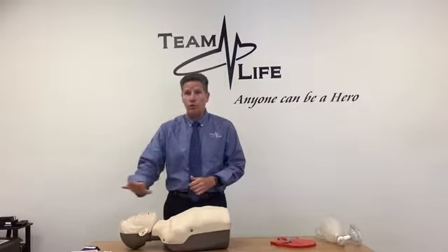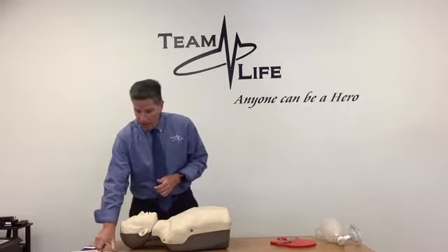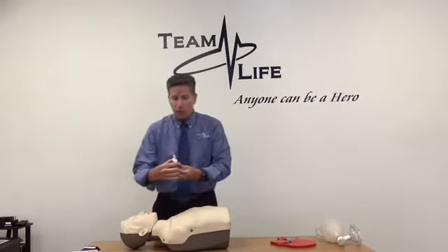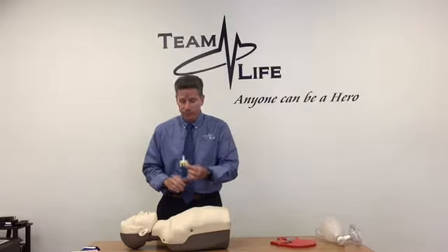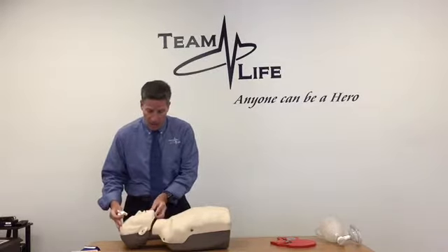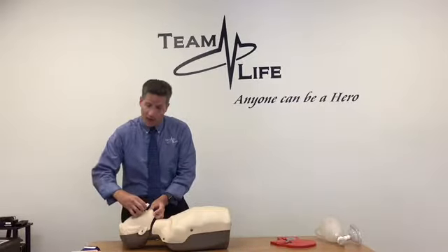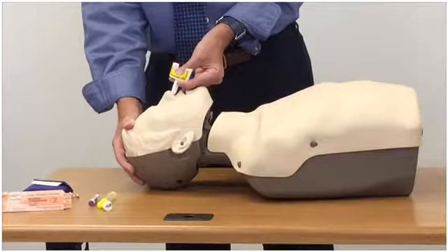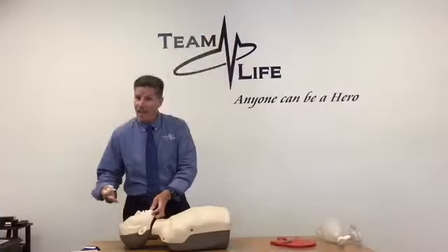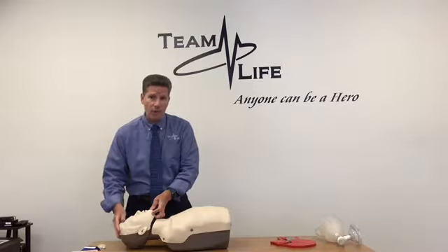I'm going to show you two different devices that you may have availability. One is a Narcan administration, which is an all-in-one set. This has one dose of Narcan in it. After I open the patient's airway, I'm simply going to put the administration right into the patient's nose, and I'm going to push down on the plunger. I'm going to keep the airway open, and if it gets in the circulatory system, you'll see a very quick response in about 1 minute.